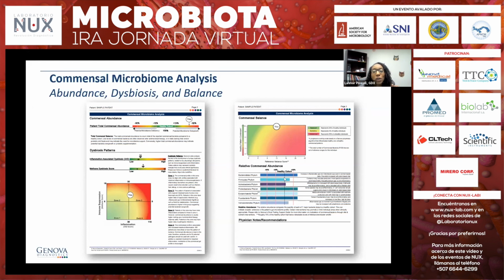But here we have the relative commensal abundance at the bottom. This is the same as the commensal abundance that we talked about on the top of page 2. We're just going into more detail regarding the individual bacteria phyla measured on this test. So although we look at 24 bacteria, they're grouped into phyla or similarities, and we have 7 of those groupings. So you can see them listed here.